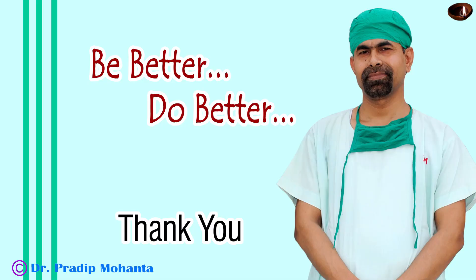Thank you very much for your attention. I hope this video will help you in managing such cases — cataracts with silicon oil in the vitreous cavity. Always remember that there is always an upthrust from behind by the silicon oil, and your rhexis has to be very careful in such cases.